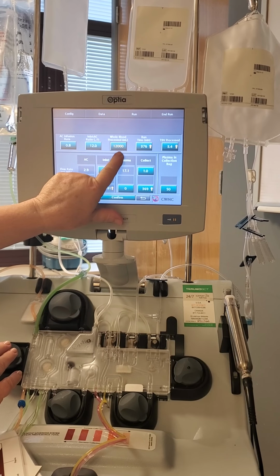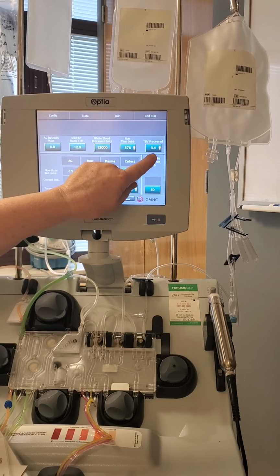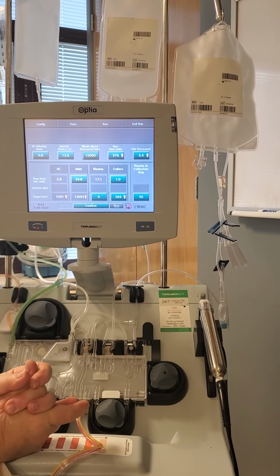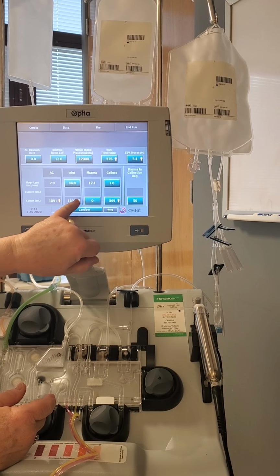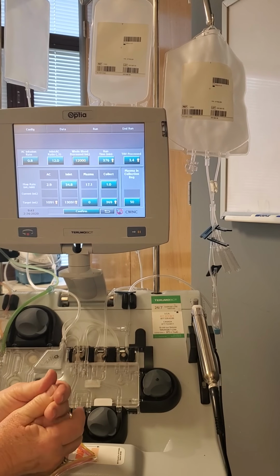So when you do 12 liters, look at how long you're going to be sitting here. And you're going to be processing almost 3.5 times your blood volume. Okay? If you're going to process longer, you're going to use more citrate, process more inlet volume, have more volume in the collect bag. Okay.